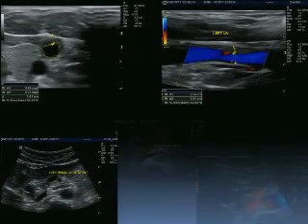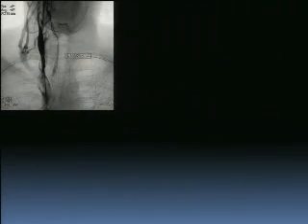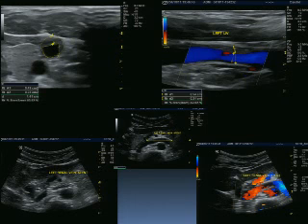Another case, also treated by Dr. Sclafani. So you get a conclusion, huh? Many patients from Athens come here. So you can see here, oops, sorry. You can see here significant residual stenosis. I follow these patients every month, and after the 3rd month, there was nothing. So there was something like remodeling.